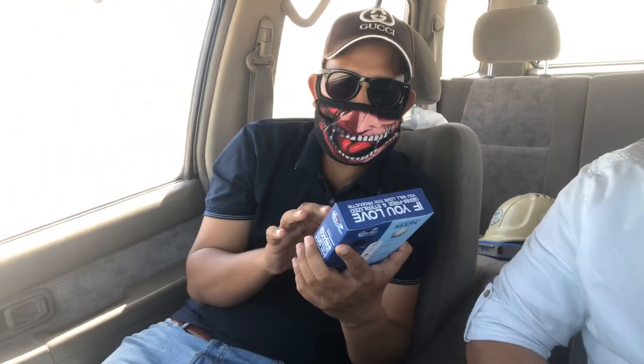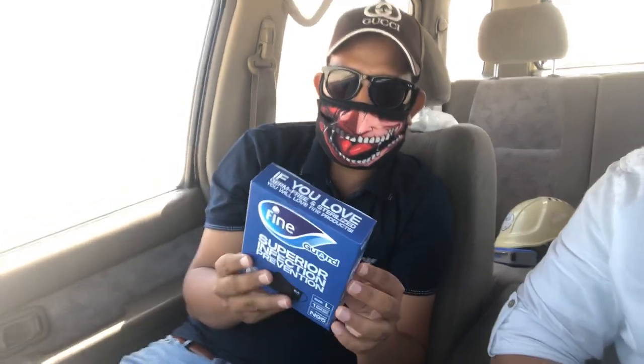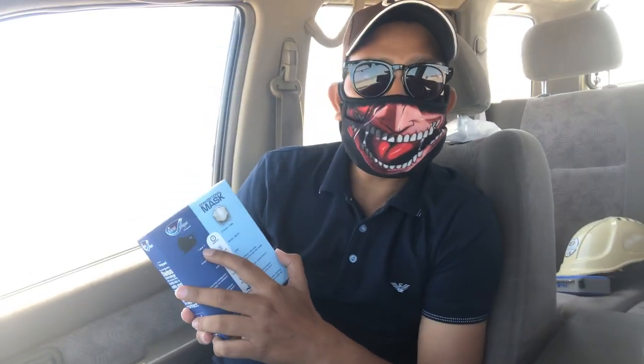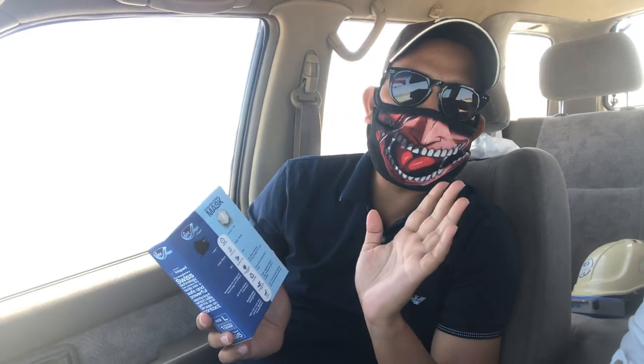This is the Superior Infection Prevention Mask. You can compare it with the conventional mask. The quality difference is that you can use this one for one year or more, whereas the other mask you can only use for eight hours — one day. If you use it again, you can become infected.